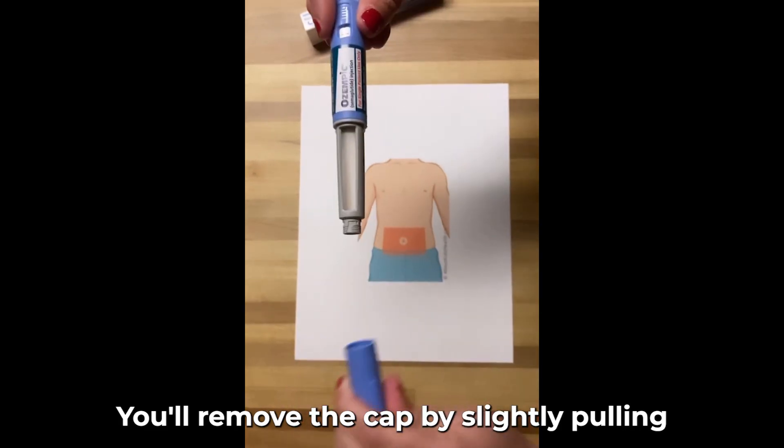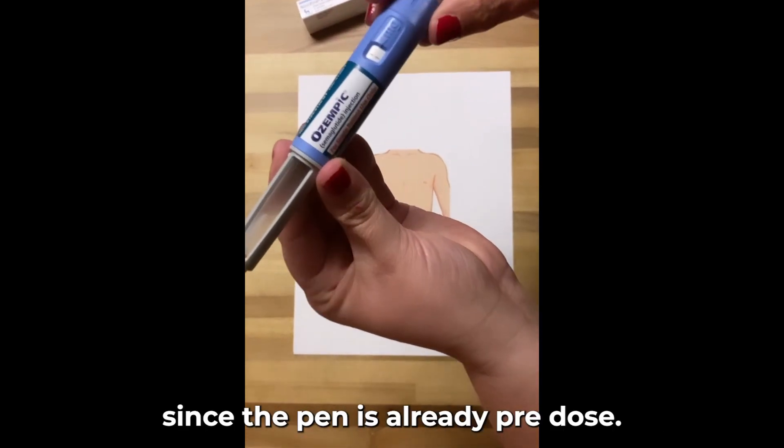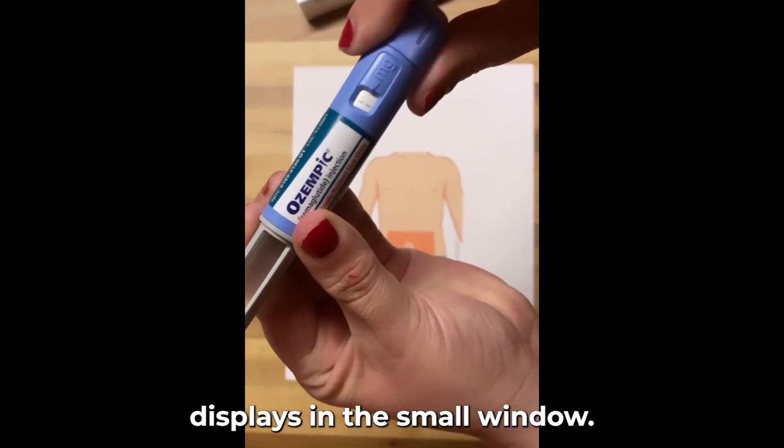You'll remove the cap by slightly pulling. Since the pen is already pre-dosed, you'll just need to turn the dial until your dose displays in the small window.